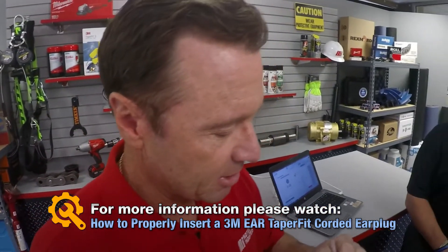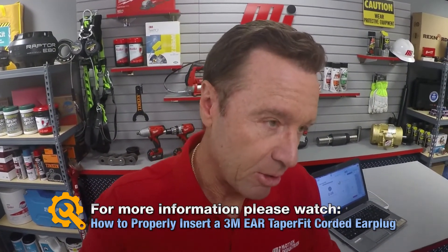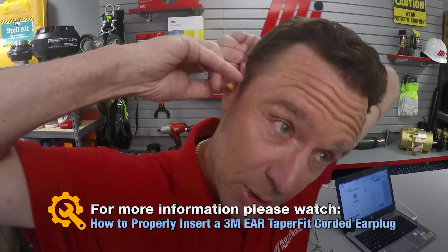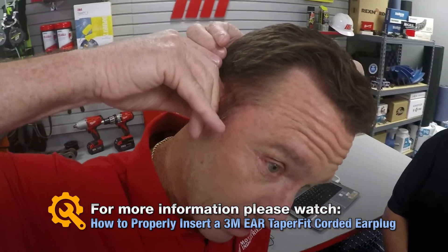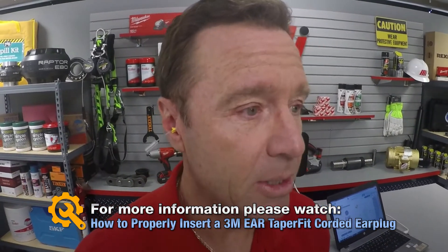And we do the same thing — we roll this. Roll it nice. And you have to make sure that you reach behind, pull up to insert, and then it goes like that and we're good to go.